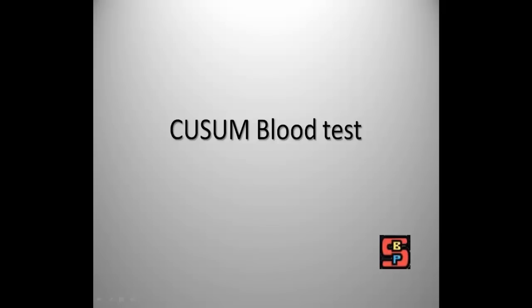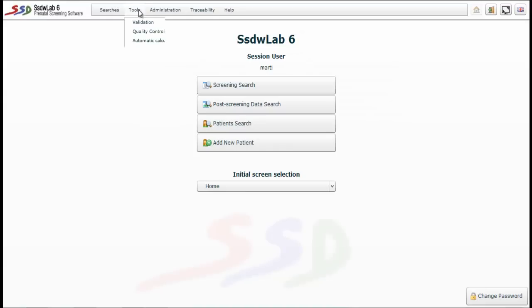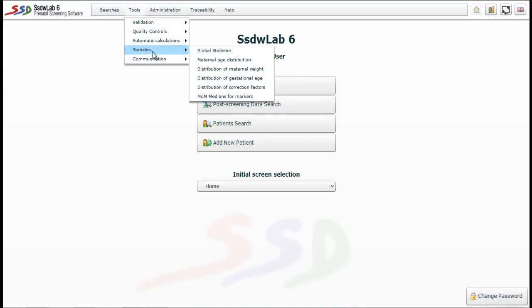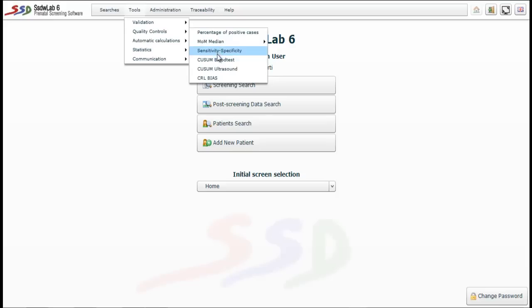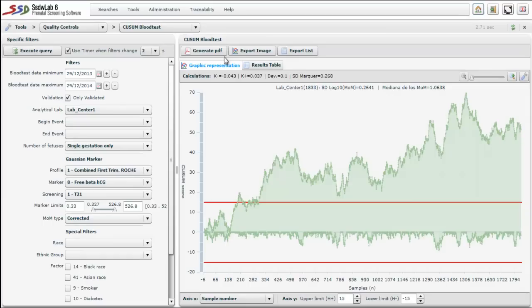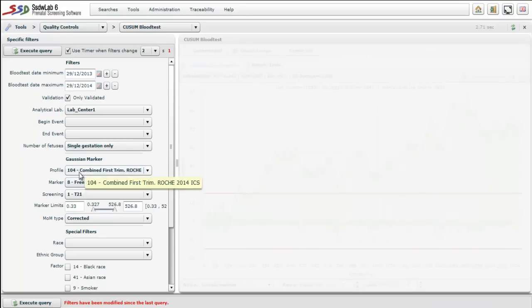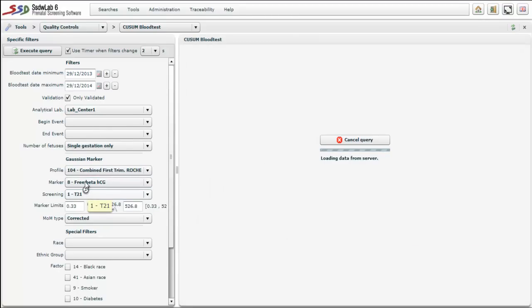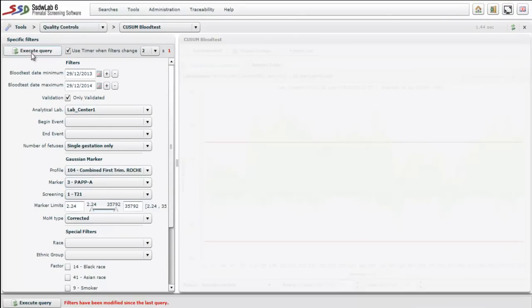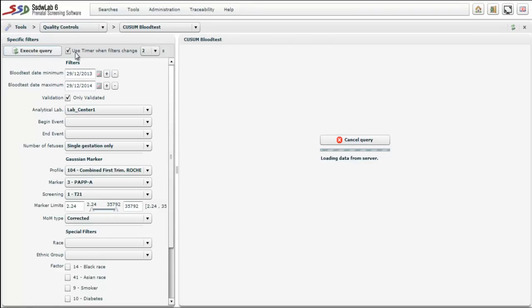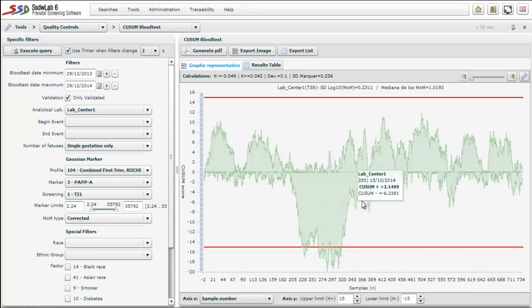We can also calculate the CUSUM for biochemical markers, which gives us an idea of how the laboratories are measuring them. We go to the appropriate menu and define our query — for example a first trimester screening profile, single gestation only, trisomy 21, and the marker pregnancy-associated plasma protein A (PAPP-A). We execute the query and see that results are quite good, as they are almost all the time within proper limits. We have seen several quality controls that will help us assess the screenings.